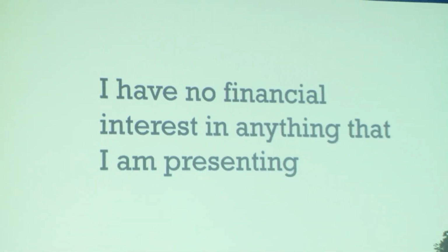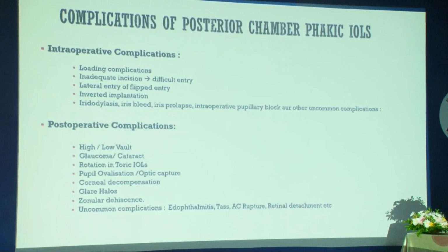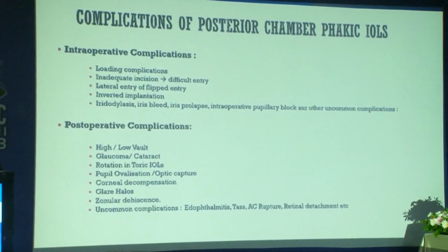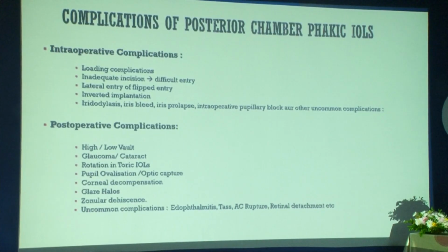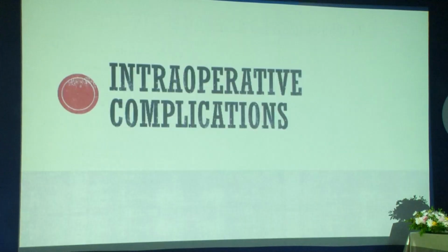I have no financial interest. So this, in a nutshell, is all the complications you can mostly face. We can divide them into intraoperative and post-operative complications. We will tackle all of these points one by one in the coming sections.